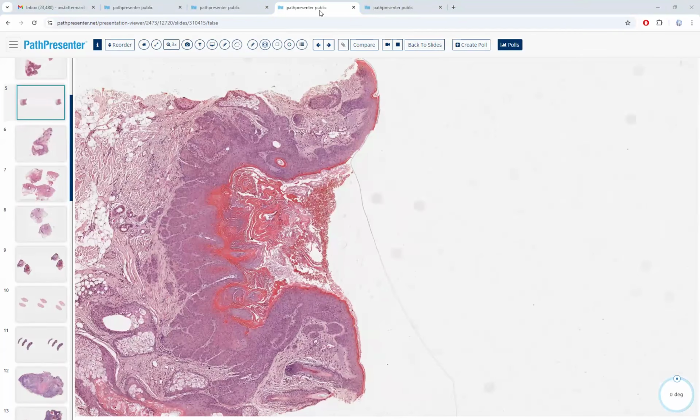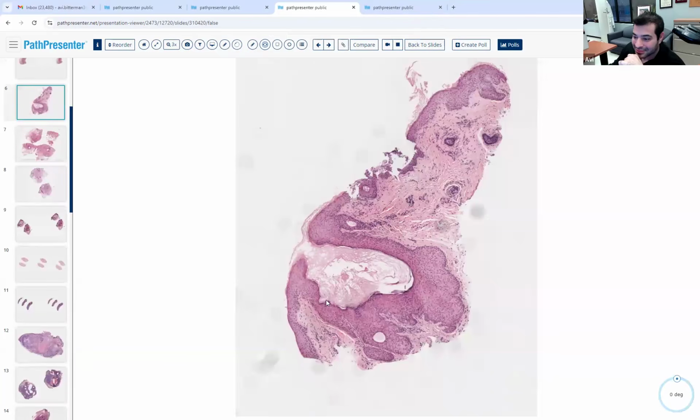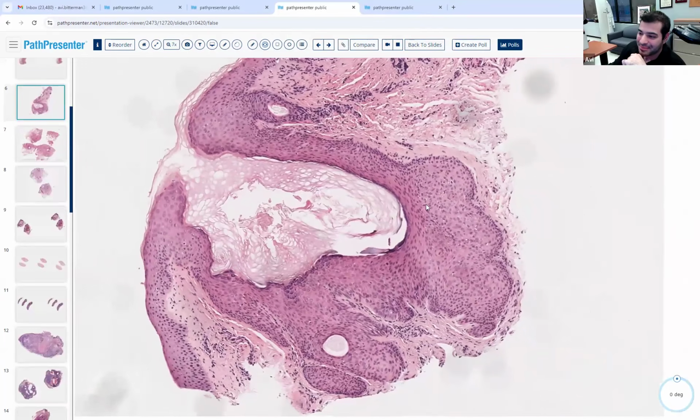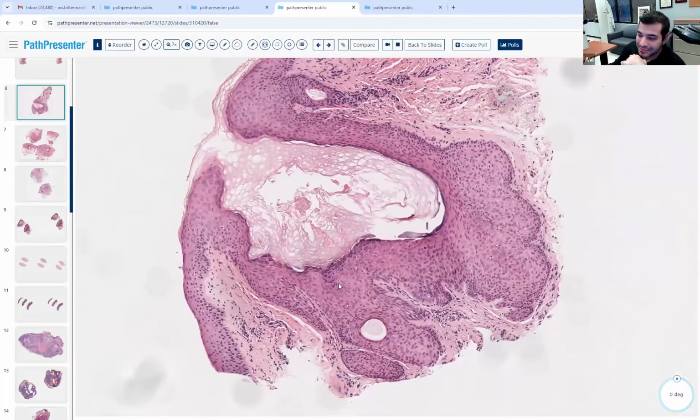Yeah, good. And Shane says pale cells and sebaceous duct differentiation are also better for pilar sheath acanthoma. Yes. Everyone see how those cells are paler? That also goes with pilar sheath acanthoma.